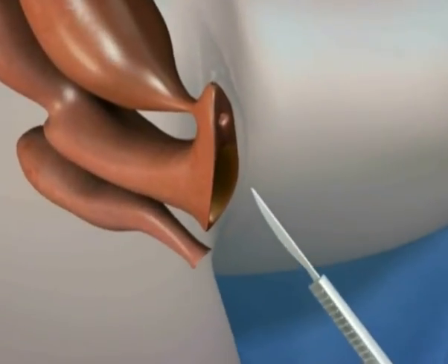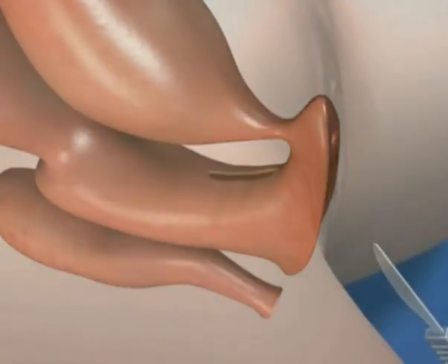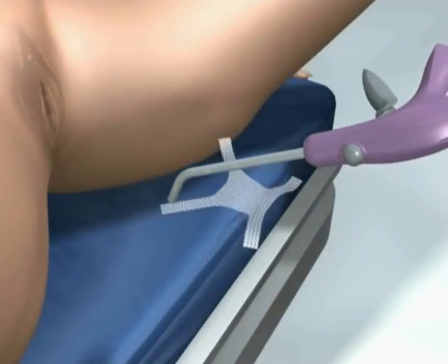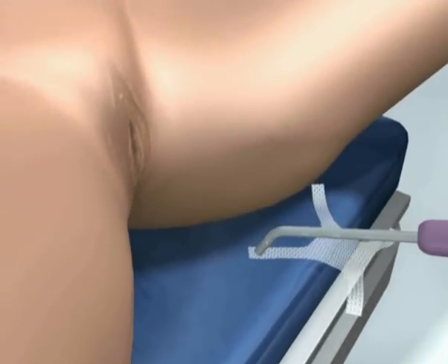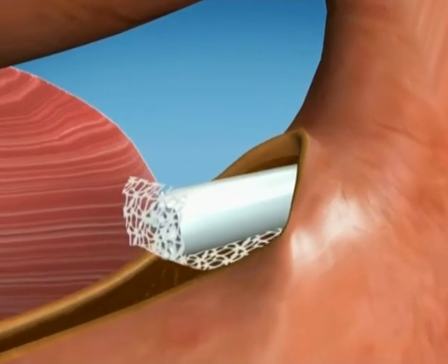For anterior wall prolapse repair, a deep longitudinal vaginal incision is made, followed by sharp and blunt dissection towards the arcus tendineus and the ischial spines. The surgeon palpates the anatomical landmarks of the ischial spines, ischiopubic rami, and posterior symphysis.